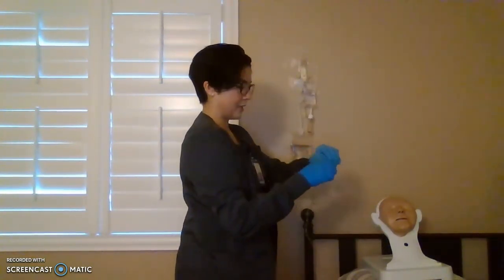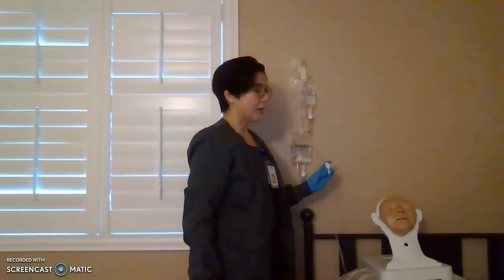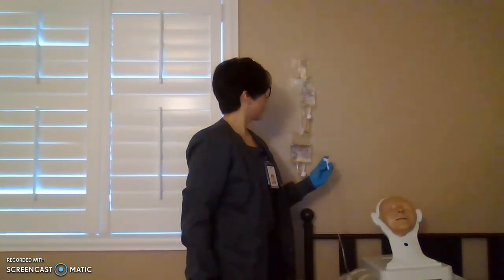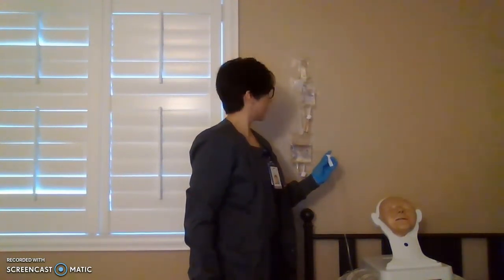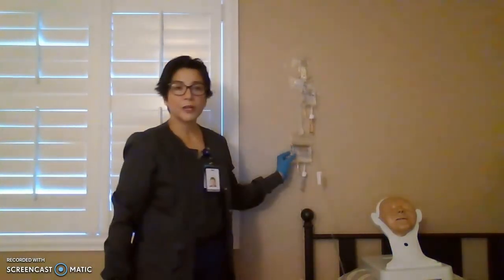Twist and attach. Okay, so that's on your patient now. And then regulate slowly. We don't want this to infuse to your patient fast, especially with an antibiotic. Count for 1 full minute again, 100 drops per minute. So we're now regulating 100 drops per minute. Okay, there we go, slowly, 1 full minute. So once that finishes, your primary fluid starts to run and finish.